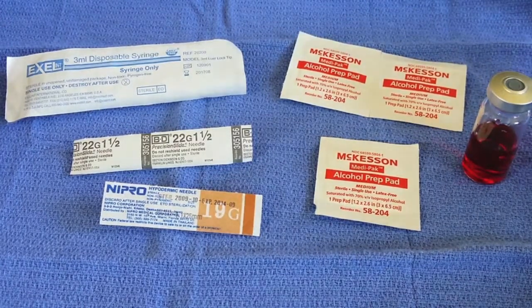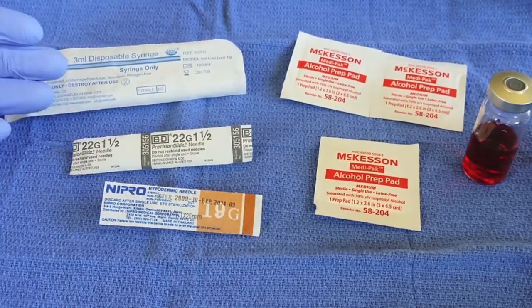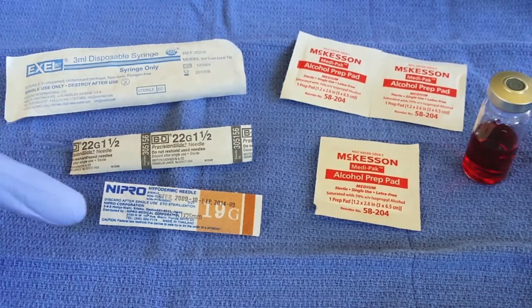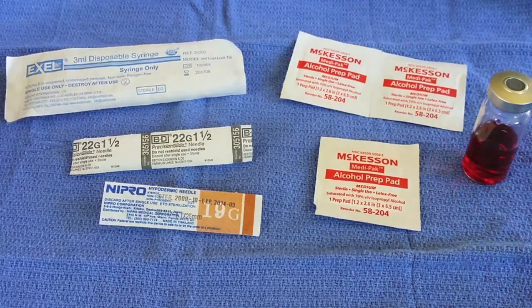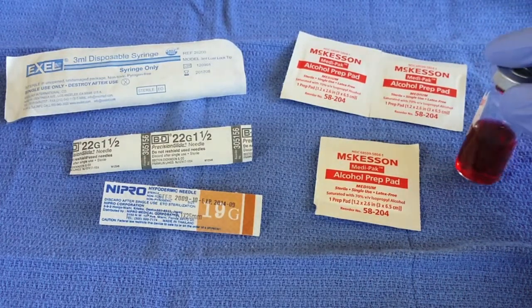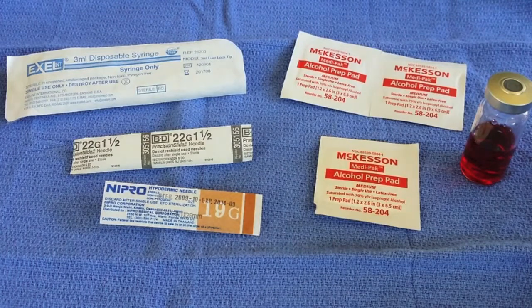Hi everyone, courtesy of Kratos Health, we will be demonstrating preparation and administration of an intramuscular injection. These are the primary supplies that you're going to need to both prepare and administer your injection. We have a syringe and two needles — one 19 gauge and one 22 gauge, one and a half inch needle — three alcohol prep pads, and our medicine or solution; in this case today we have a B12. Whether you're injecting B12, testosterone, or some other vitamin, the preparation and administration process is going to be virtually the same for all intramuscular injections.